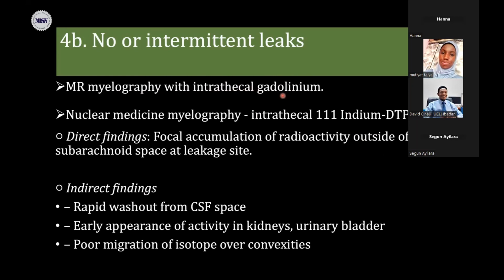So it's good for cases where there's slow or intermittent leaks. You'll be able to image the patient even after the first day of the procedure. They can also do nuclear medicine myelography, where they inject intrathecal 111 indium diethylenetriamine pentaacetic acid, and you evaluate to see direct and indirect findings.